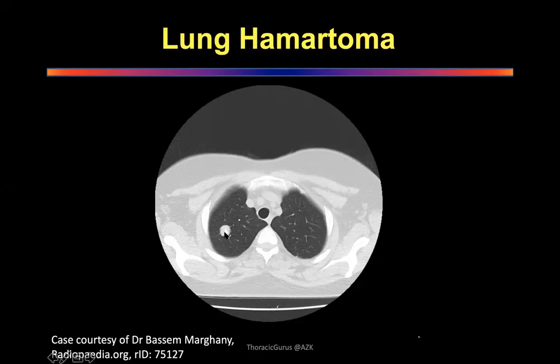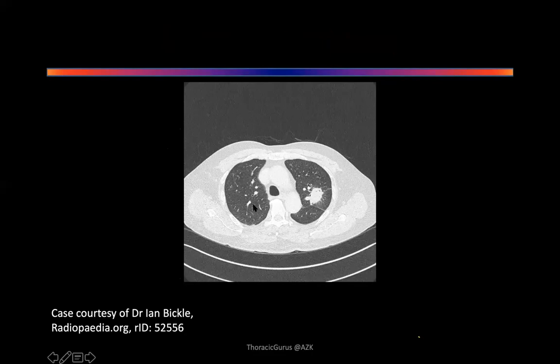But because there is calcification in the midline and it's very well circumscribed, it is more likely to be a benign lesion. Yeah. The common benign lesion is a hamartoma. Okay. Excellent. I like the fact that you said you want to see the previous chest X-ray. Well done. Right. Vikas, if your connection has improved, can you come in and tell me about this?